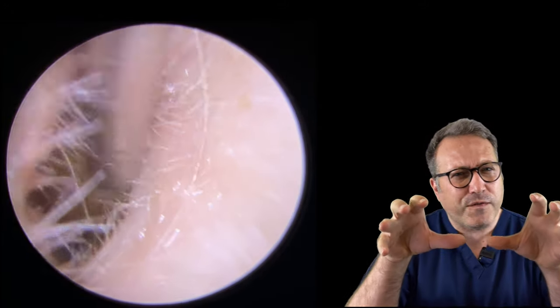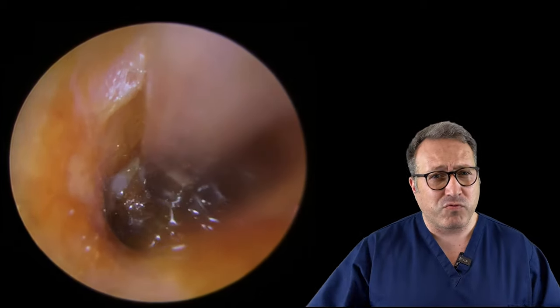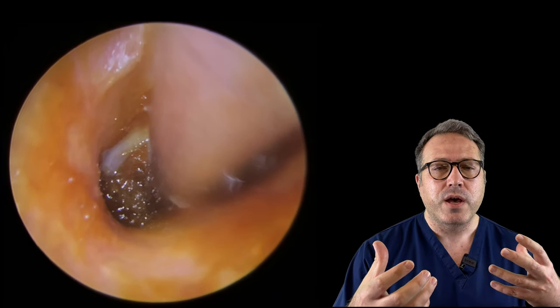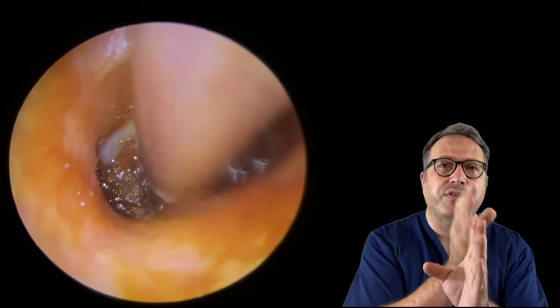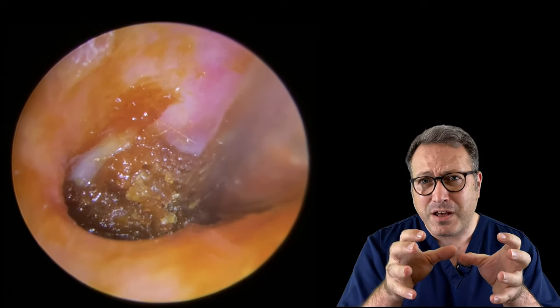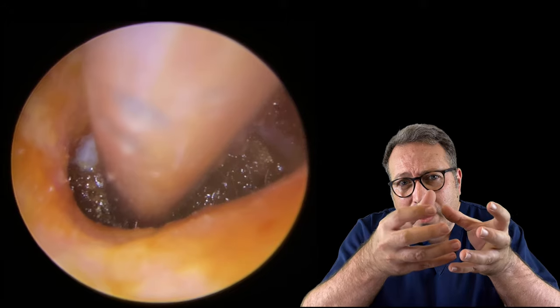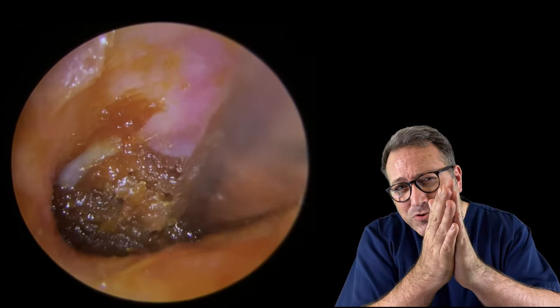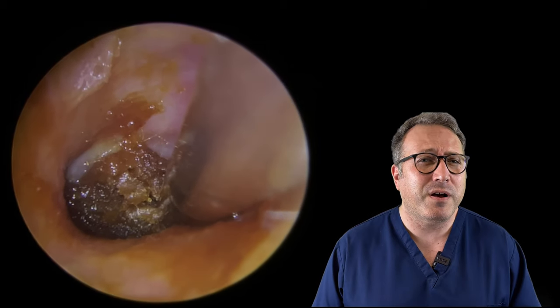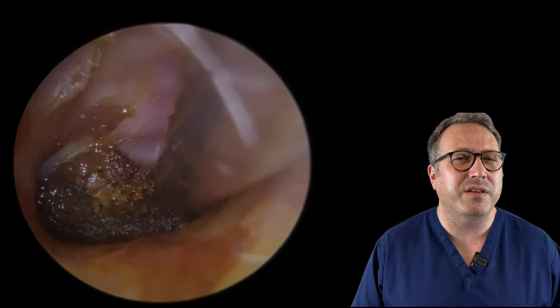What we've got now is this really, really tough section at the base - it's really just jammed right down in there. I'm putting in a lot more olive oil, really throwing it at this, mainly because of patient comfort. If you imagine trying to take something away from the eardrum that's actually physically stuck to a very thin skin membrane, you've got to be ultra careful peeling that away. You also want to make sure your patient is comfortable, because you will see little flexions of the eardrum every now and then as we're pulling against the wax - it's actually drawing against the eardrum and bending it ever so slightly.